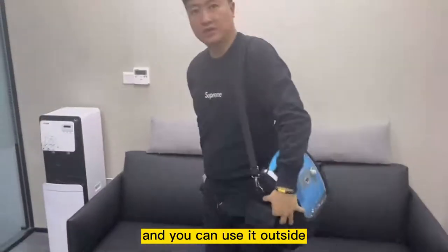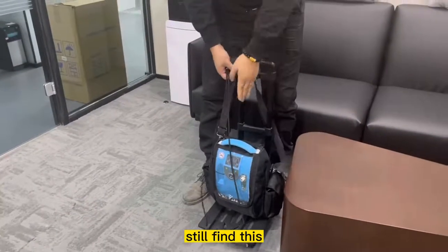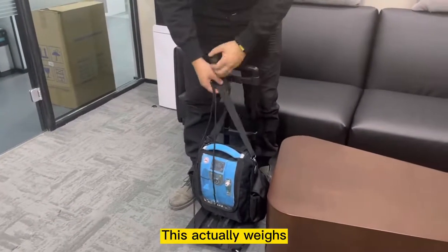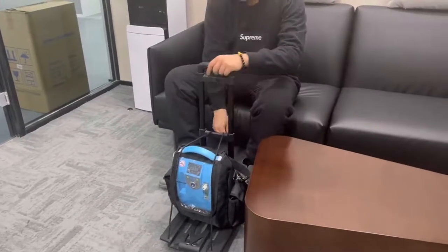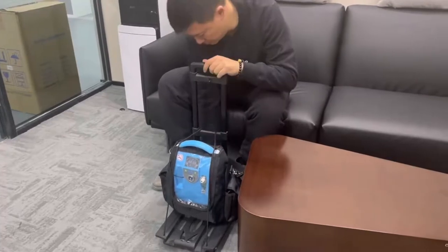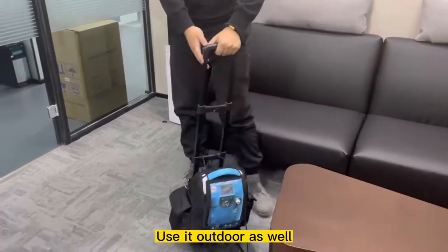Okay, just put it on and you can use it on the go. And of course, it also comes with a trolley — just place it on the trolley. If you still find this a bit heavy, this actually weighs around 5 kg, so you can just put it on the trolley and strap it up. You can just use it on the go as well.